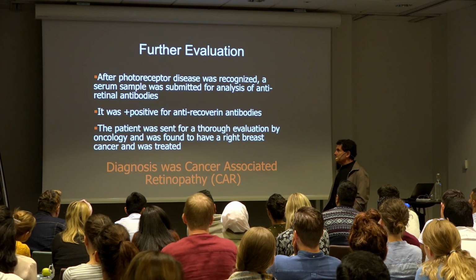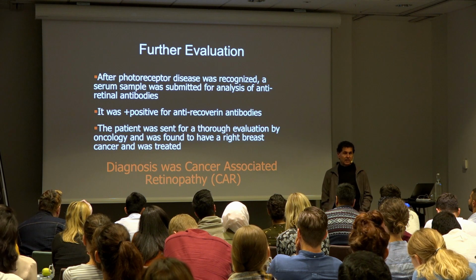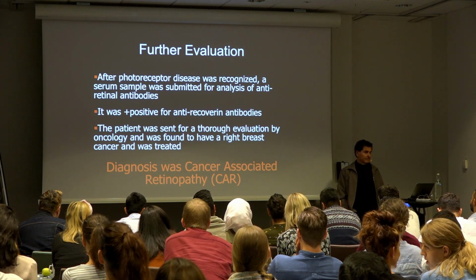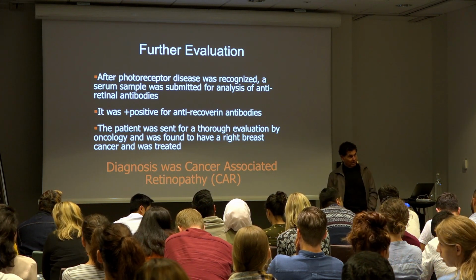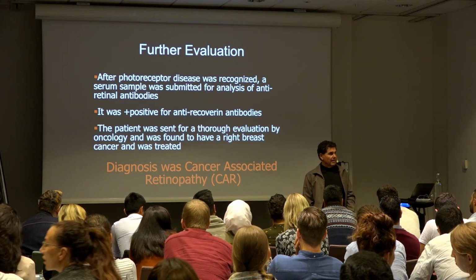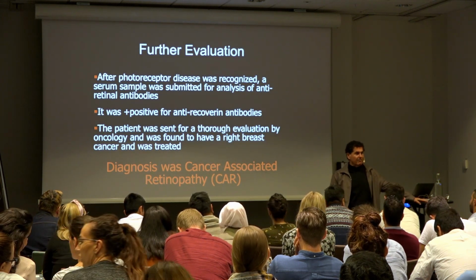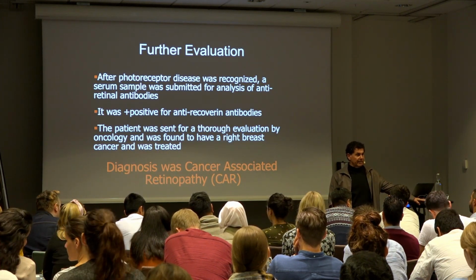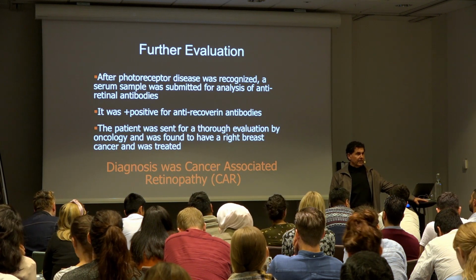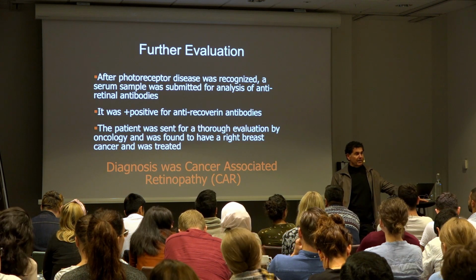So here's where, you know, I think putting together the history and the symptoms and the OCT helps. Is this a typical patient of CAR? Depends on what stage you get them. At the early stage, they may not have much structural loss and have an abnormal ERG. And then later on, as you get more dropout of the photoreceptors, you get thinning.